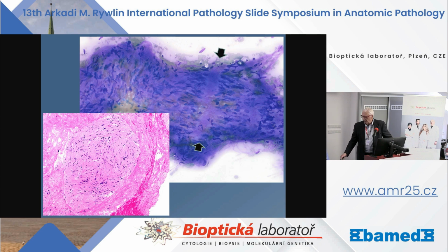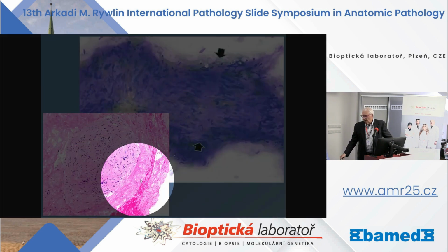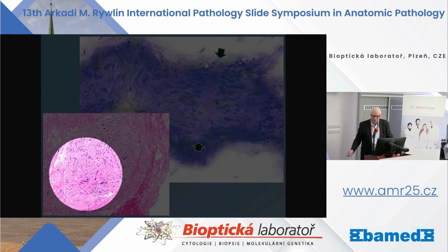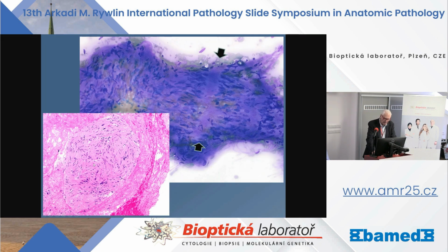I called the surgeon. In fact, let me show you, this is the cell block. The cell block is right here with the H&E right here. Obviously, a little bit of anisonucleosis is present here. S100 positive, SOX10 positive. We made a definitive diagnosis of schwannoma based on that.